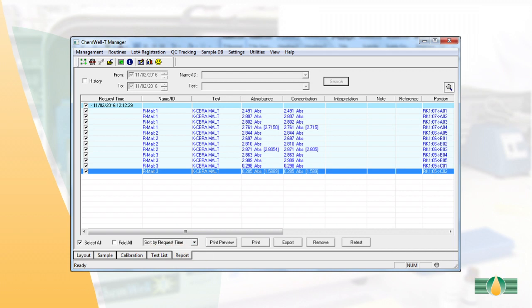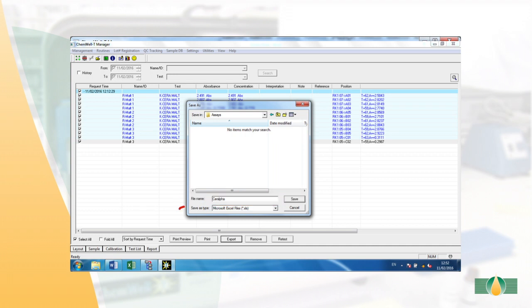To export results, highlight the results in the report tab, select export, then input a file name. Select Microsoft Excel files and select save.